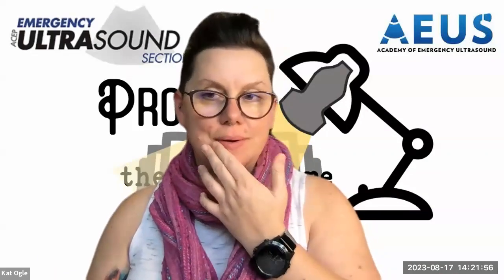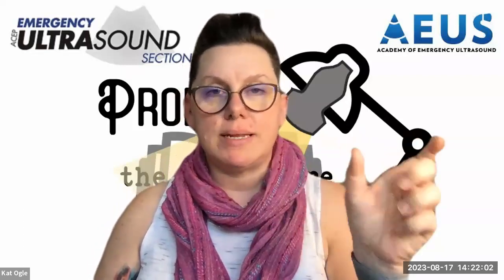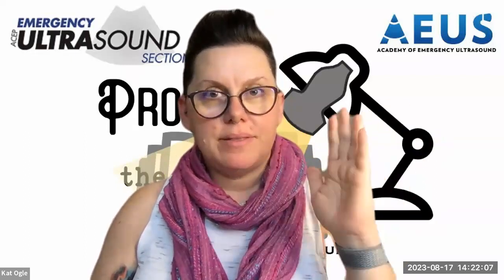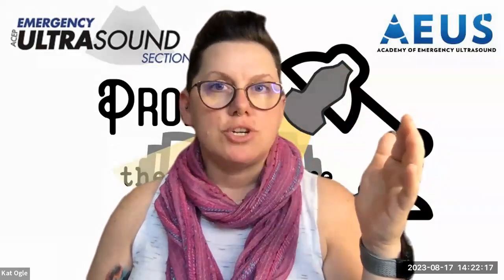And Dan, to your question about non-educational systems changes, what I will say that we have incorporated since that time is that when we are reviewing QPath and we filter for trauma cases and they're not submitted within a week of the actual case, we will do a chart review and look for the trauma flow sheet. We will queue it out as undocumented, but we'll bill for it because we can say that it was negative or positive in the trauma bay and correlate that with any of our comprehensive studies.